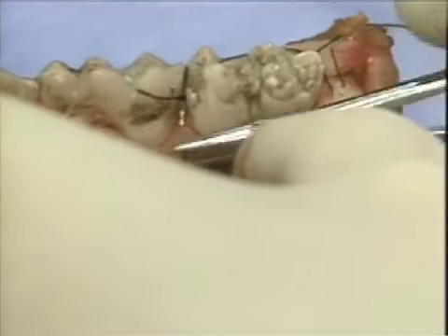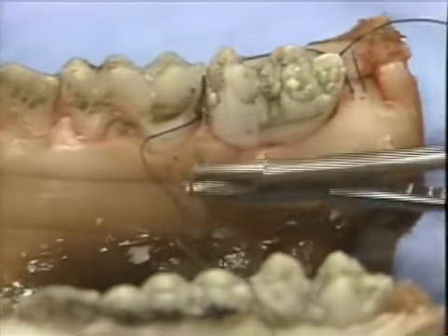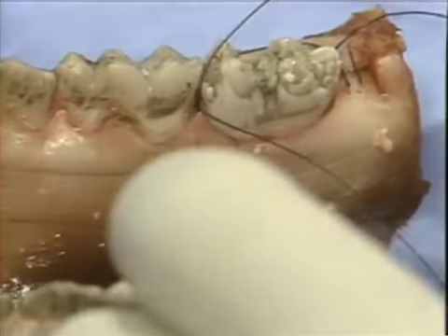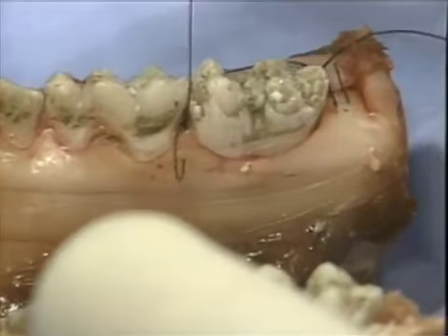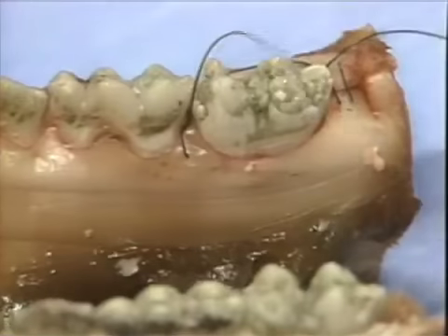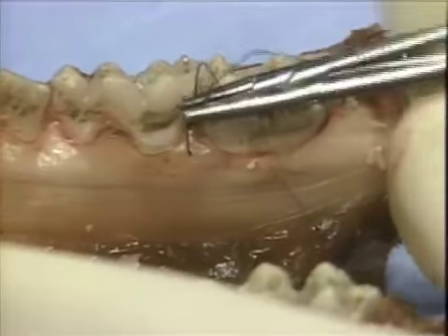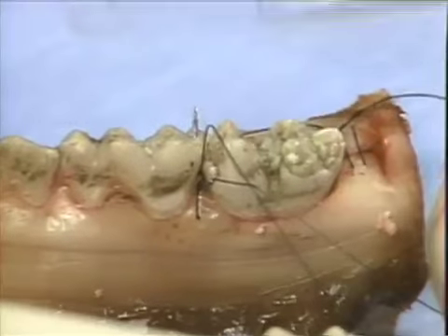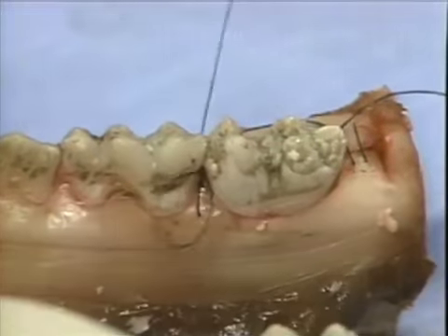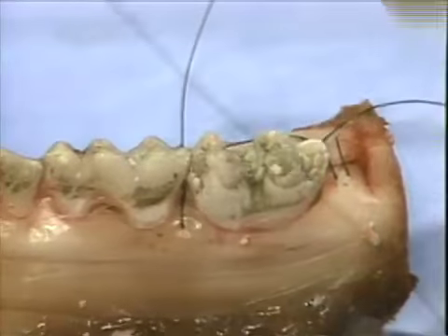Suture is placed in this instance in the lingual flap, is passed back through the interproximal area and is slung around the opposing buccal surfaces of the mandibular teeth. In this example, the sling suture allows the operator to position the lingual flap at a position independent of the buccal flap and to suture the lingual flap at a tension that is different from the buccal flap. This cannot be accomplished with an interrupted loop or other interrupted suture design.